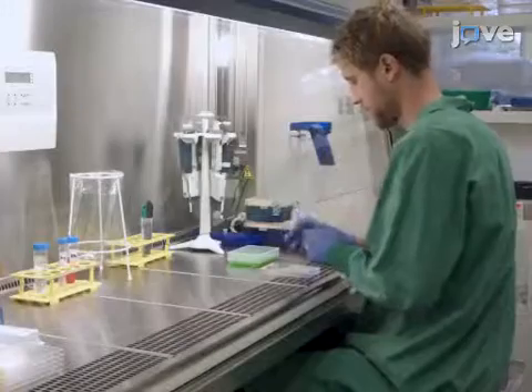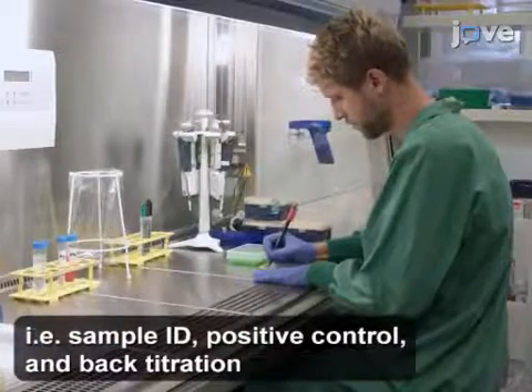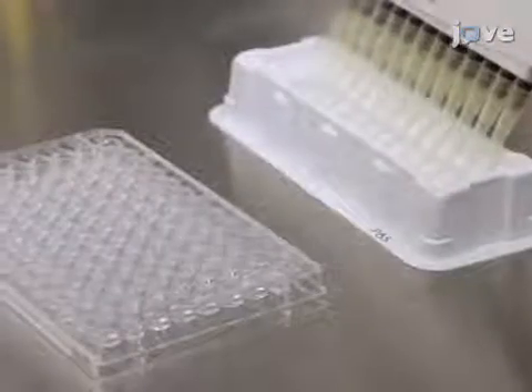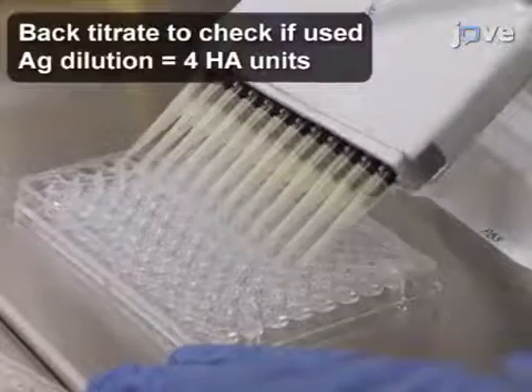Begin by labeling 96-well microtiter plates with the appropriate experimental information. Then turn the plate in the vertical orientation and use a multi-channel pipette to add 25 microliters of PBS to every well except the first well of the bottom back titration row.